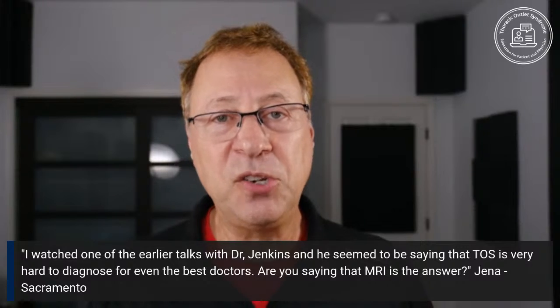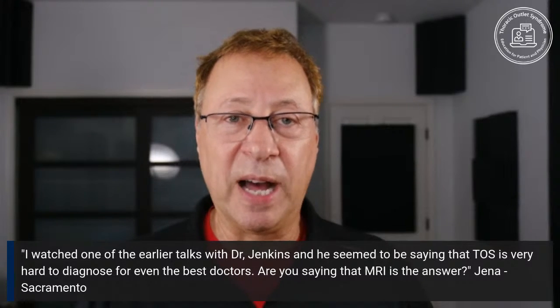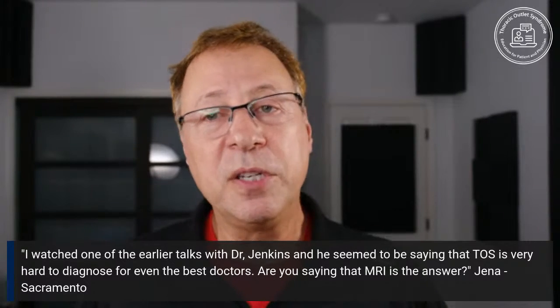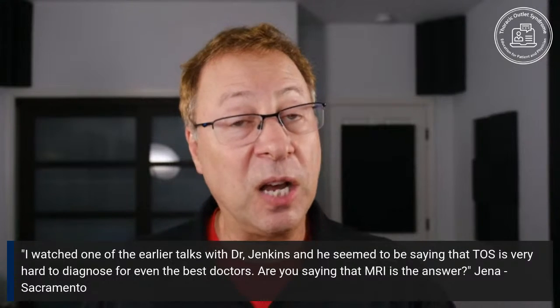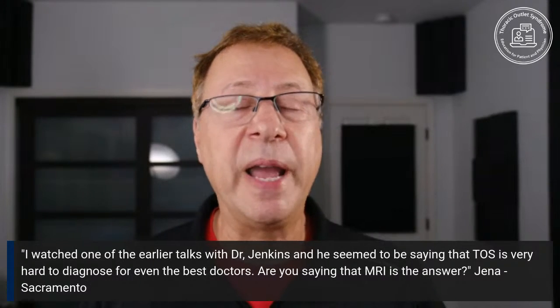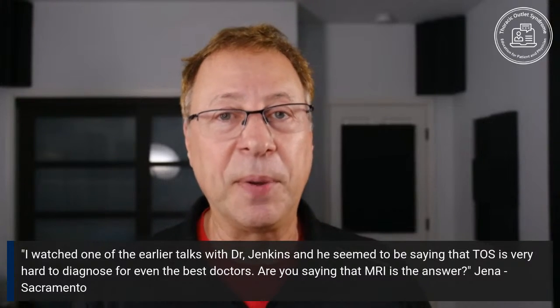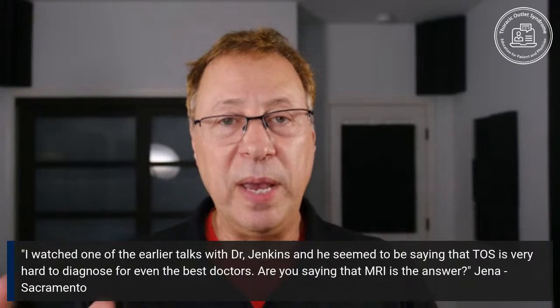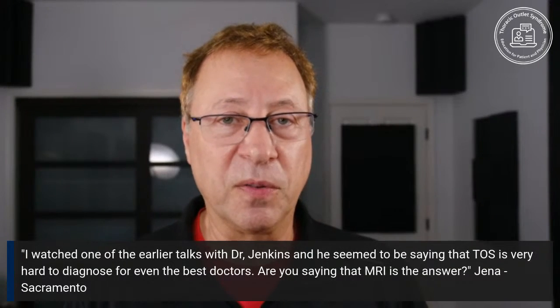And that combination is widely accepted in medicine as being diagnostic of that particular entrapment neuropathy. So TOS is the same thing. It's an entrapment neuropathy. The nerves themselves start out normal. They get compressed or stretched by any of a number of mechanisms. And just like every other entrapment neuropathy, cubital tunnel syndrome, carpal tunnel syndrome, we apply MRI, we show the nerves, we show everything around the nerves.